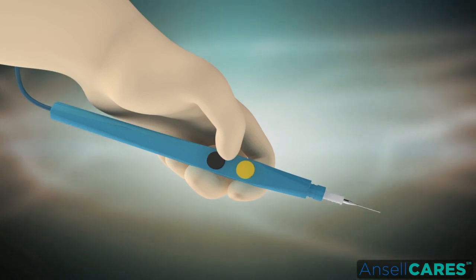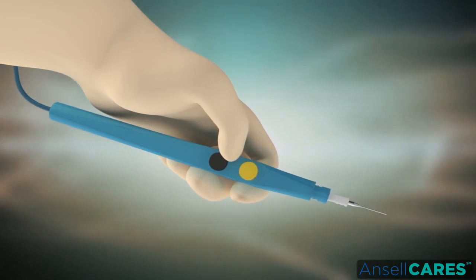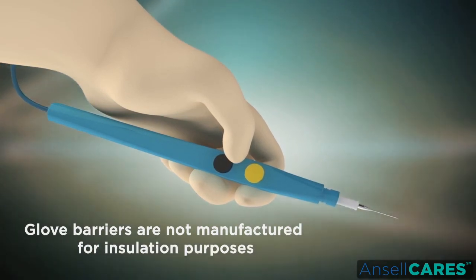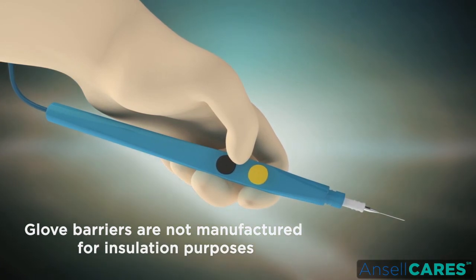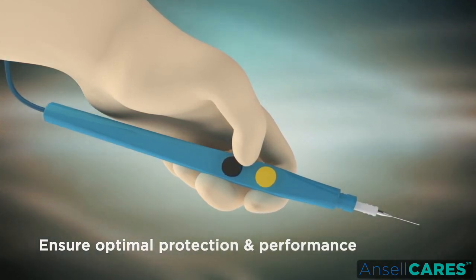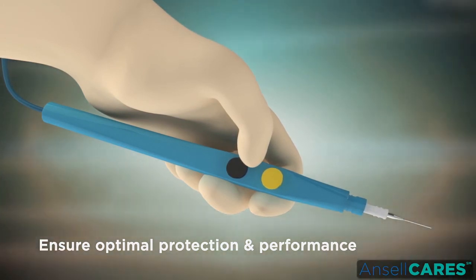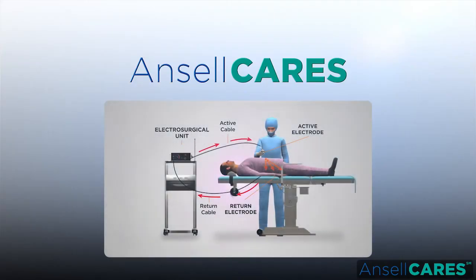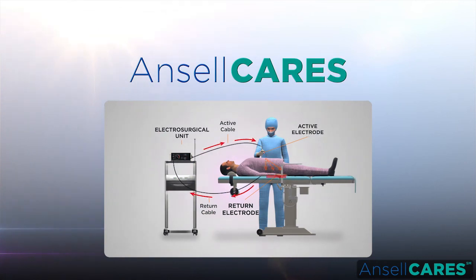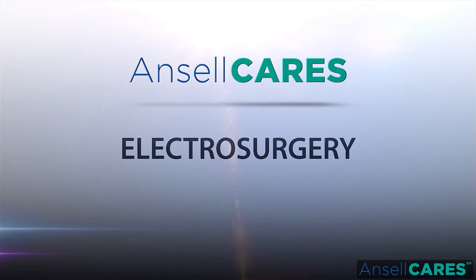Surgical gloves may be considered a non-conductor due to the insulating properties of rubber, and may be considered by some to act as an insulation medium when performing electrosurgery. However, glove barriers are not manufactured for this purpose and therefore should not be relied upon to provide fail-safe insulation. Understanding how to ensure optimal protection and performance is crucial in healthcare, particularly given the risks related to blood-borne pathogenic diseases such as hepatitis and AIDS. Electrosurgery has gained popularity for its cutting precision and effectiveness, but it is important to keep in mind the significant precautions required when using an electrosurgery device.